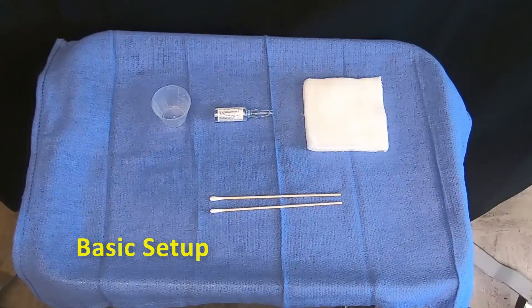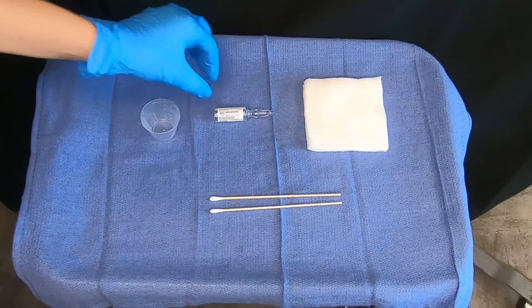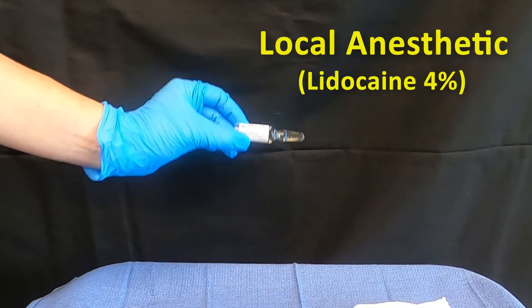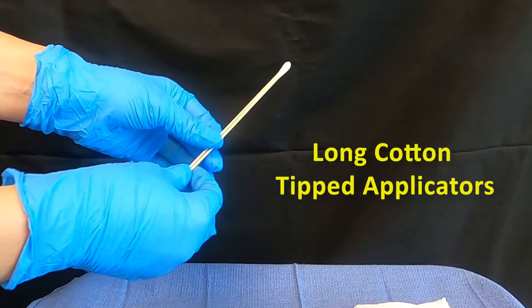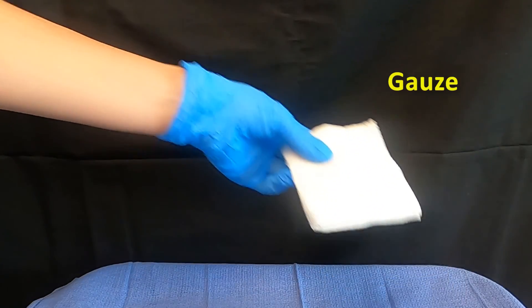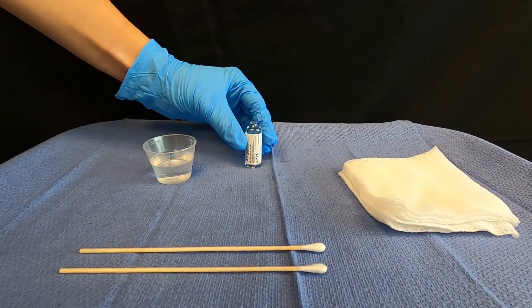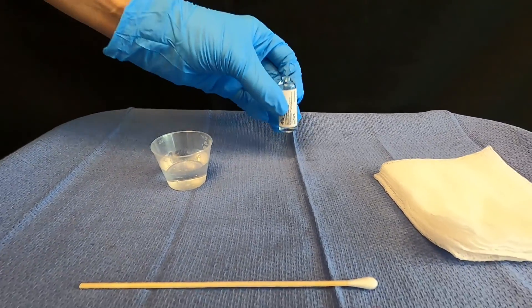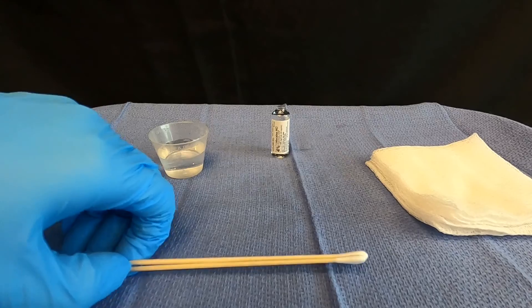Supplies include a small container, your choice of local anesthetic — we will be using lidocaine four percent — two long cotton-tipped applicators, and gauze. The local anesthetic is poured into the small container, and both long-tipped applicators are soaked in the local anesthetic.